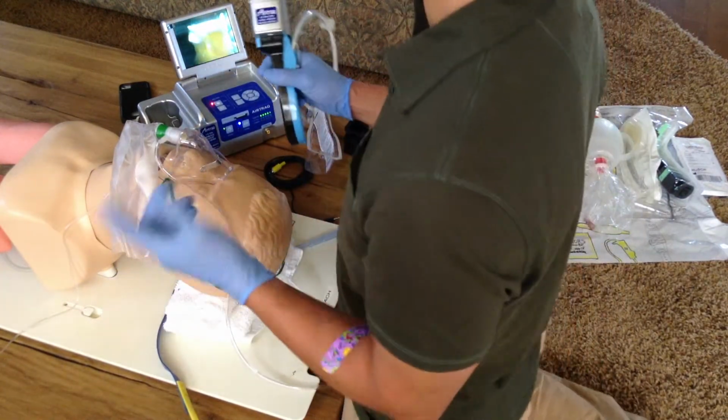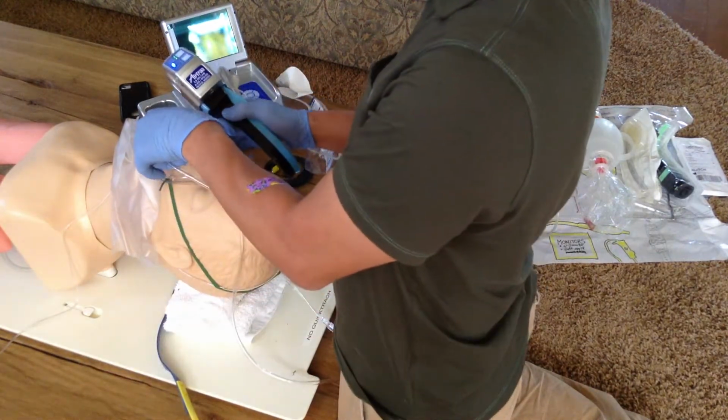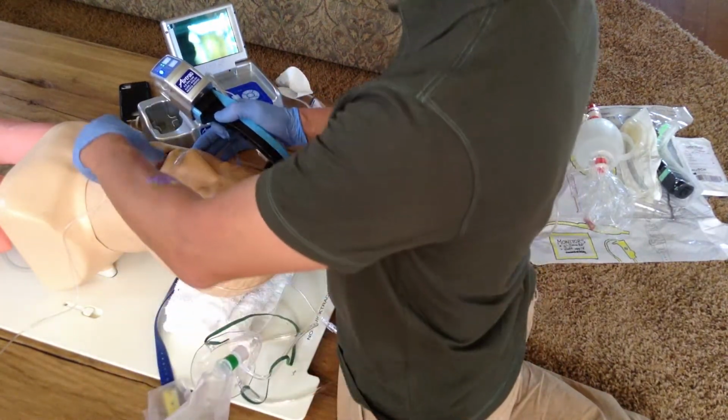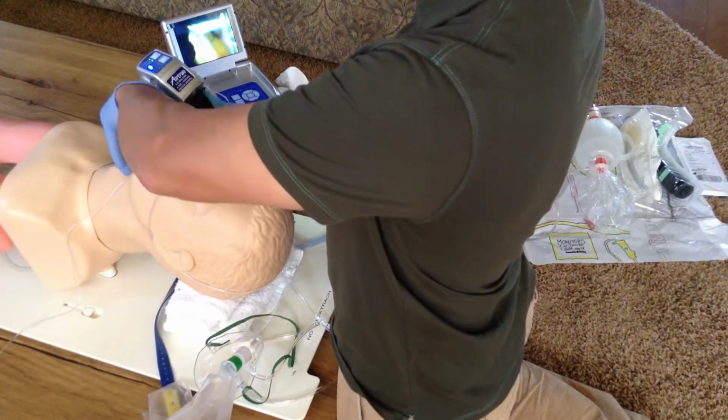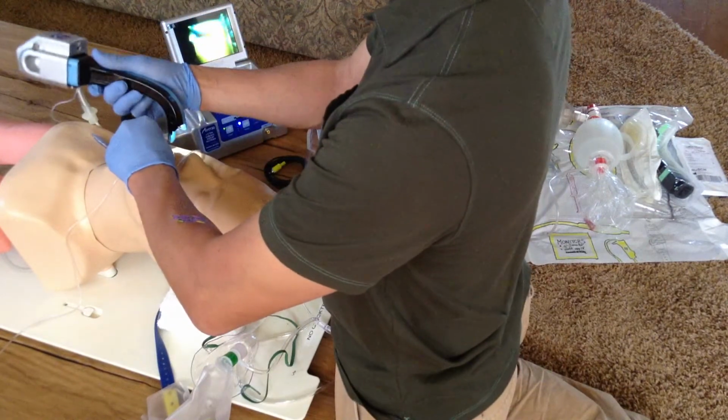So patient's pre-oxygenated, fully relaxed, we're ready to intubate. So basically take this off, midline approach. If the patient's not going to bite you, you can pull the tongue and jaw forward. Getting that tongue forward is helpful.